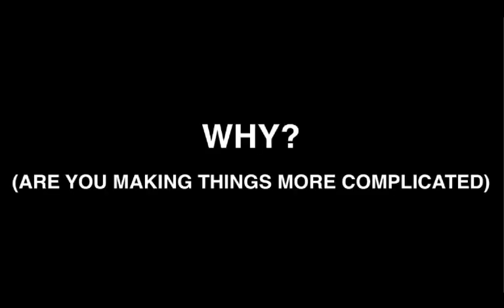Why are you doing this more complicated approach, you might ask, right? I already have my Rush. It takes me 1 minute, I get all the views, I hit them up. Remember that it's almost like a spinal reflex. They walk in, they're hypotensive, I do a Rush. I got it down. Why would you make things more complicated? Fundamentally, ejection fraction, which is what we're assessing in the majority of cases, is just not a good marker of LV function. So this distinction between ejection fraction and stroke volume is one that you really need to understand when you take care of critically ill patients.